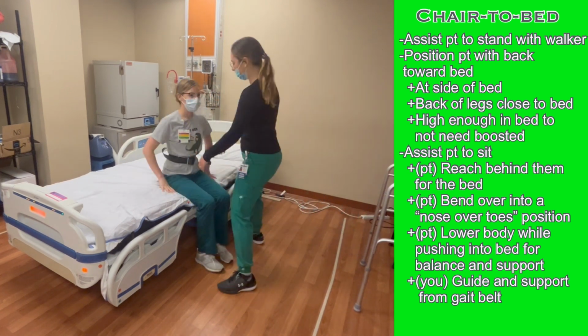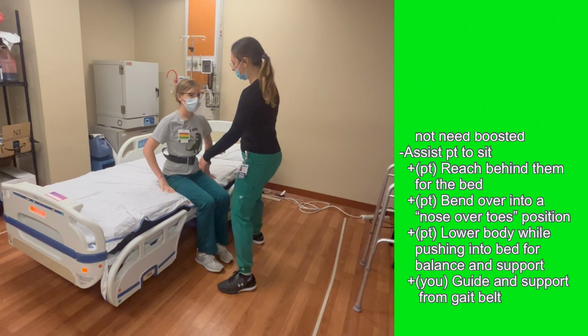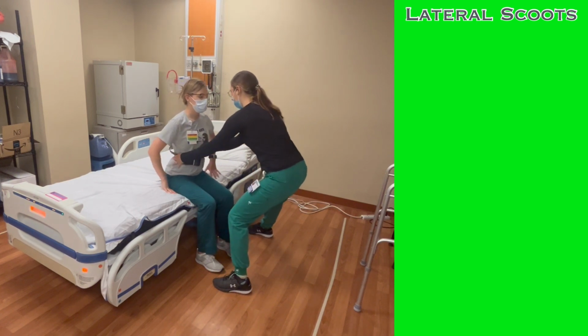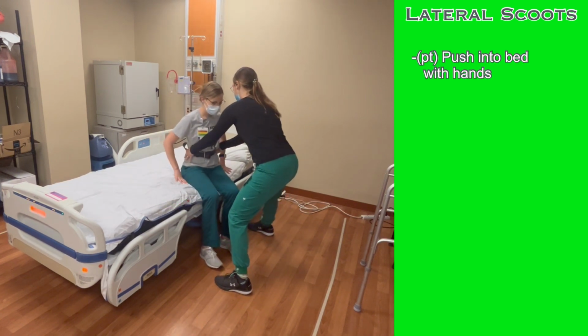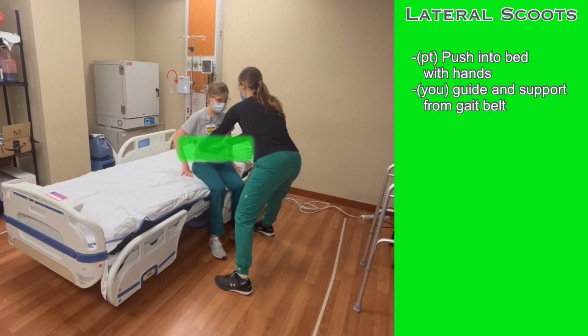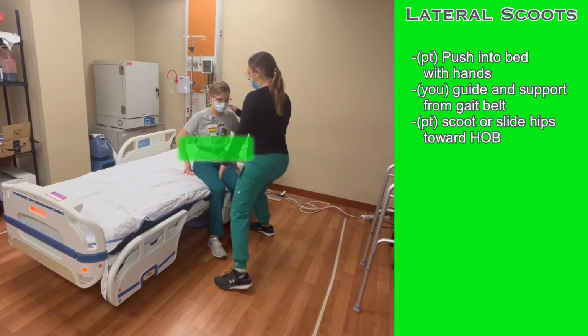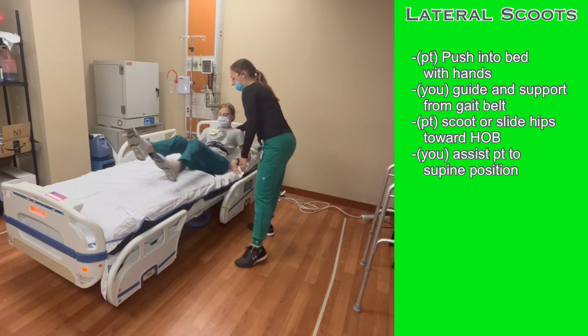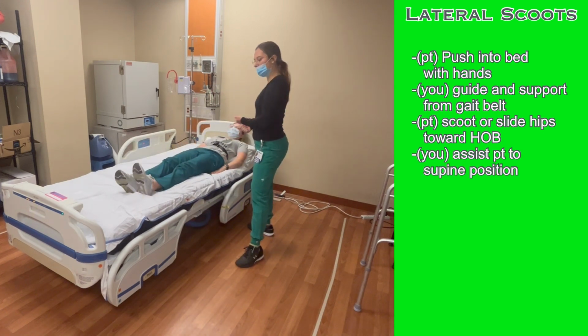If the patient is sitting at the side of the bed, but is too low in the bed, you can assist the patient in performing lateral scoots to position them closer to the head before laying down. Have the patient push into the bed with their hands, and you can support and guide from the gait belt as they take small scoots toward the head of the bed. When they are in an appropriate position, have the patient lay down, or assist the patient to a supine position.